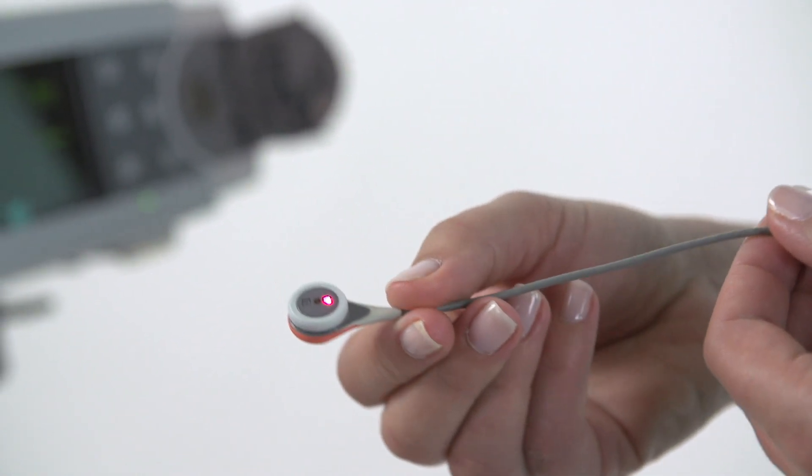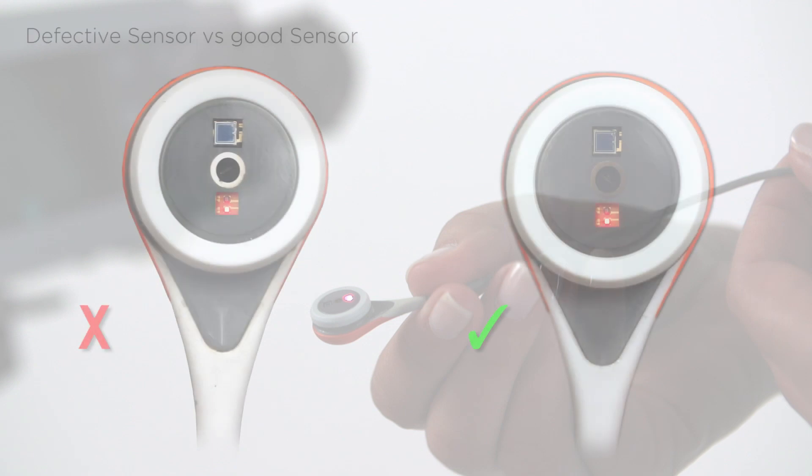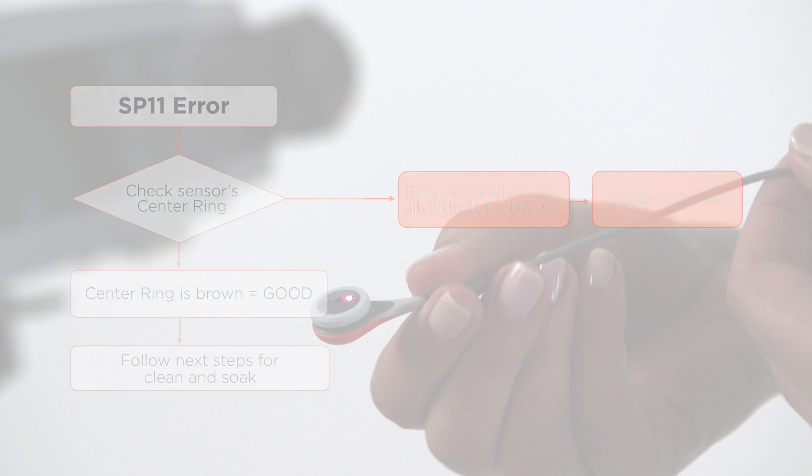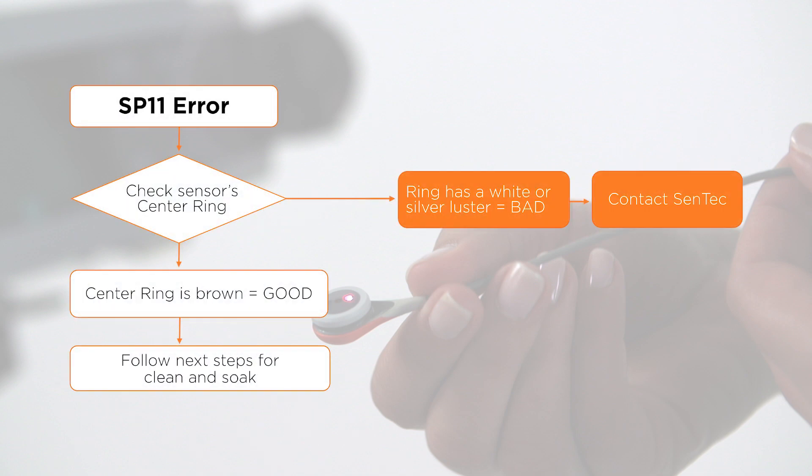Please contact Sentec if the ring has a white or silver luster as shown on the left sensor. The following steps will not resolve the error message.